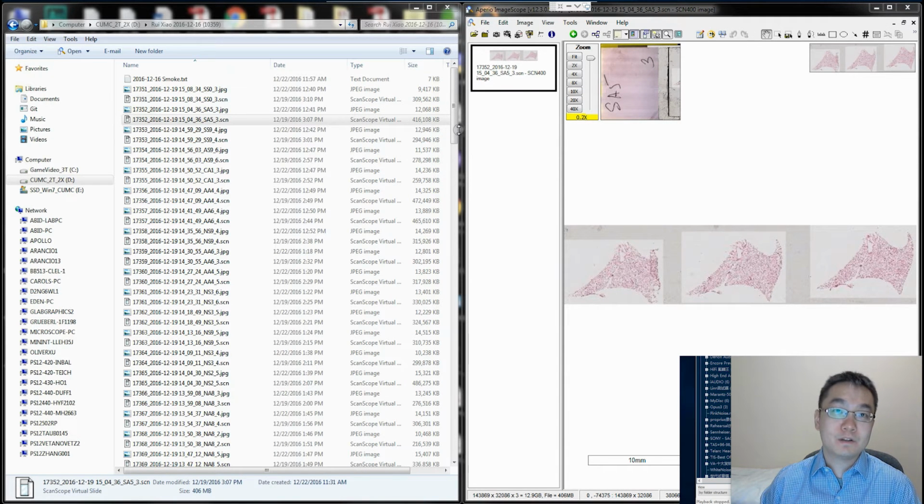If you are interested in learning how to use the Parenchymal Airspace profiling method and the software, then you are in the right place. I'm going to show you my usual workflow. Hope this video can help you with your future research.